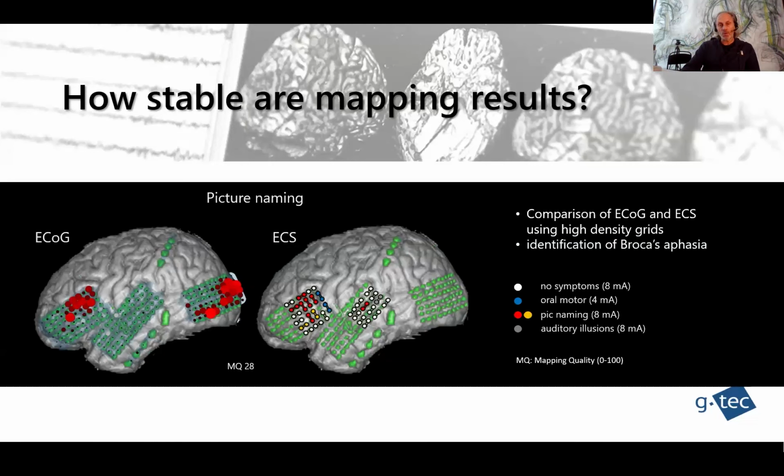And then we compared it also with electrical cortical stimulation. So Peter Brunner will talk a lot about that in his keynote lecture today.